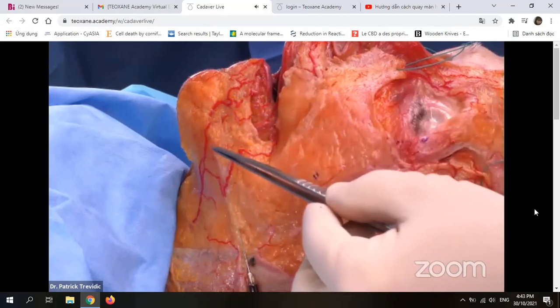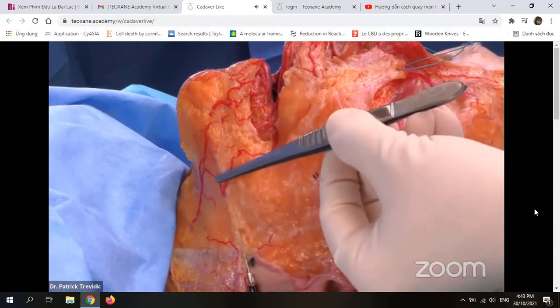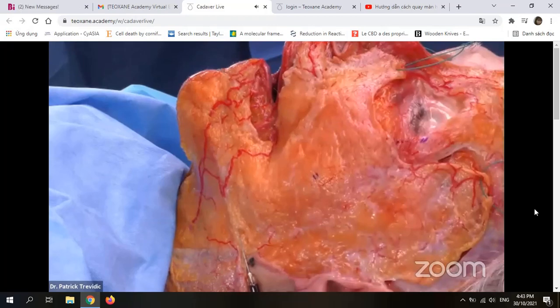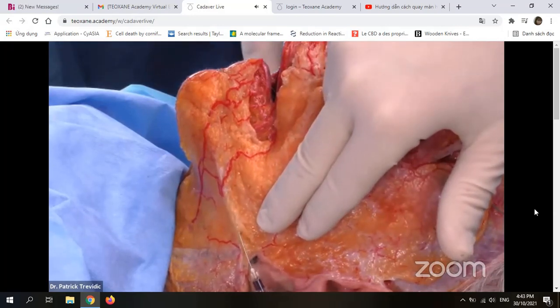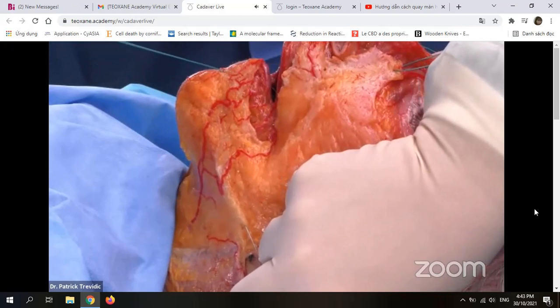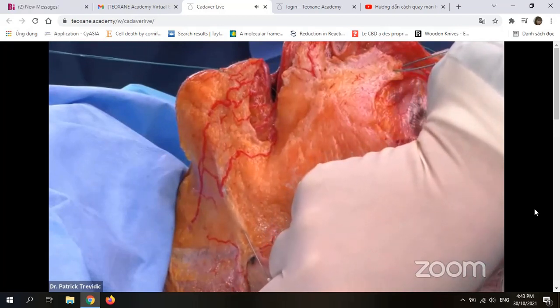This is why in this area, even if the main danger is deep, that is the facial artery, I will start with an injection in the superficial way like Nabila was doing, as you can see here. When you inject in this area, I will inject a little bit, so here you will see the blue here.